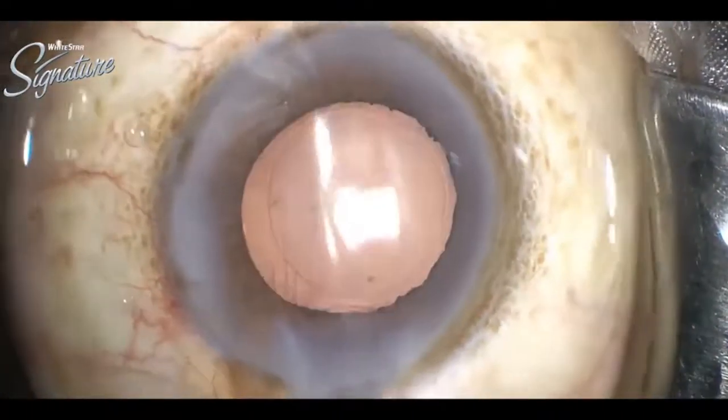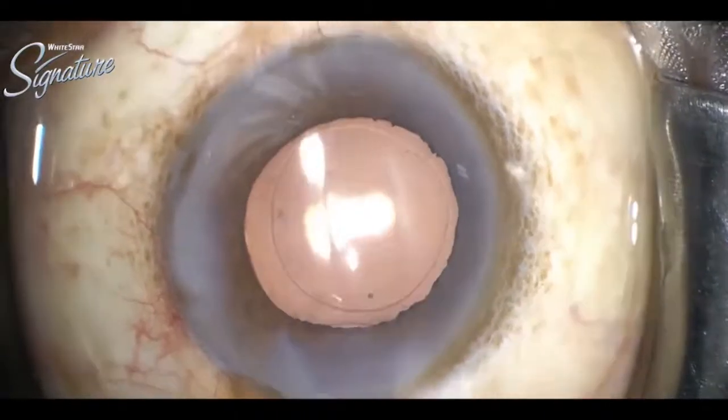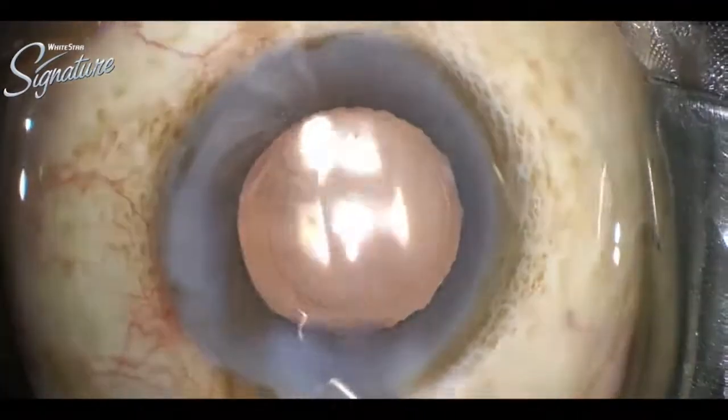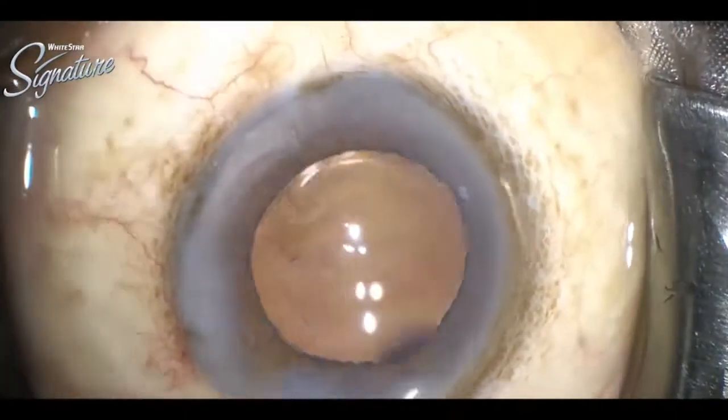Now the ports are hydrated and smoothened. This case of dense brown cataract with phacodonesis was very nicely managed by Dr. Sri Ganesh. Thank you.